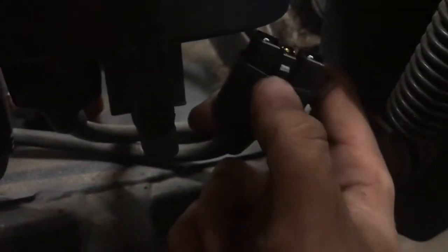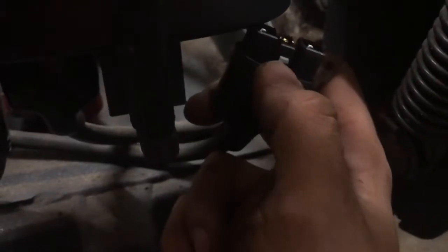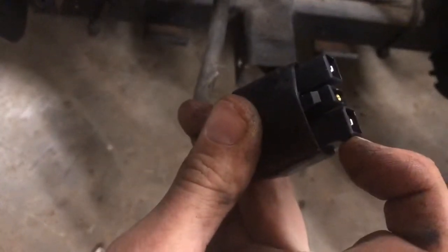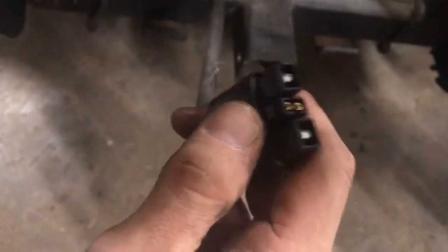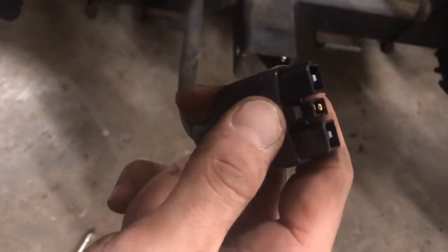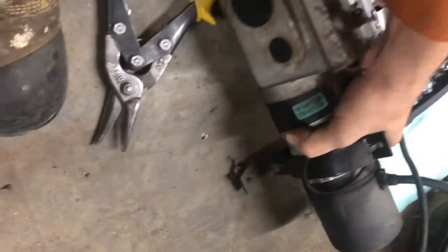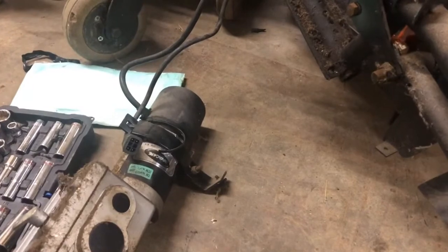So here's the actual motor plug. You can see when I press it down, it pushes this pin down, and I can actually take it off without breaking this clip. If you do break the clip, what I would do is, on one side, put just a drop of super glue right there, so it shouldn't fall out. But anyway, you can see it better now when I press it in, and then wiggle it up and just pull it down as you're wiggling. Make sure you keep that pressed down though. Okay, so now we feed it through. And ta-da! Now your motor's off. So just reverse the process. Sorry about that. So reverse the process and you'll be good.